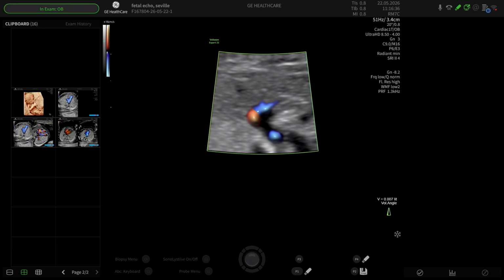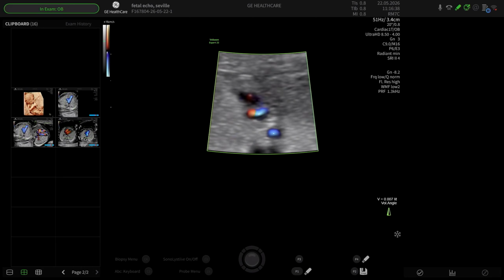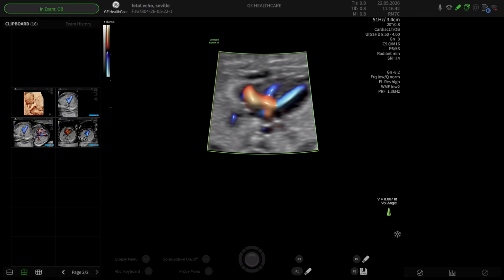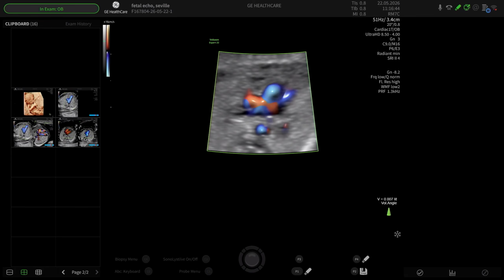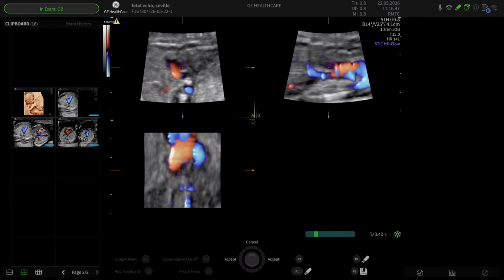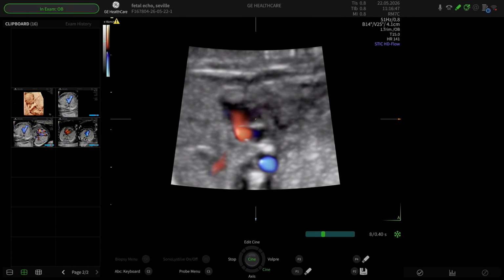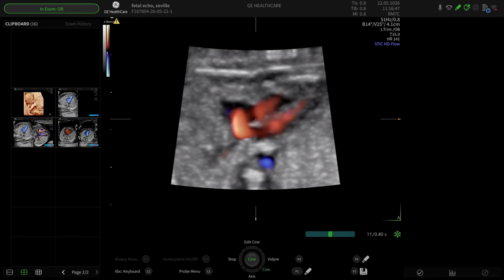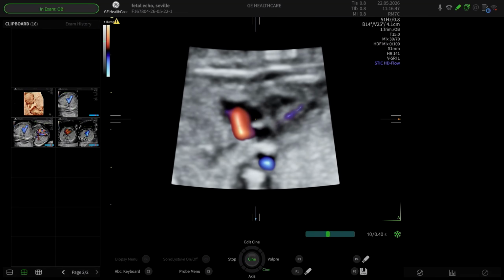And then I sweep, going from a 4-chamber up to the 3-vessel tracheal view, and I catch the ventricles and sweeping up to see the right ventricular outflow tract, sweeping up to cross the transverse arch. And you can see I fell just very slightly short. When I select that A plane, I very quickly go to the A plane, I translate to get my 4-chamber view, and then I press this button called STIC VCI, and that gives me a nice fill.